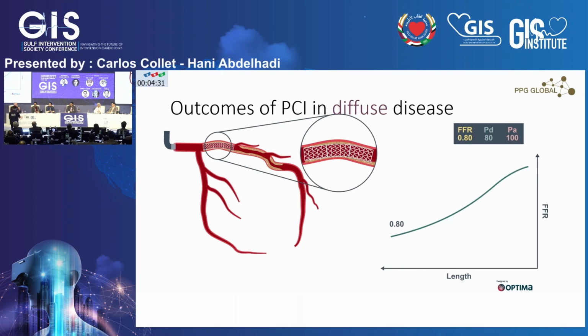The second case with diffuse disease was an issue. I mean, there are times where we've seen these stented, and that's the worst thing you can do, which is a full metal jacket in an LAD, where there's no benefit to the patient. So I'm quite happy with the decision making for both sides.